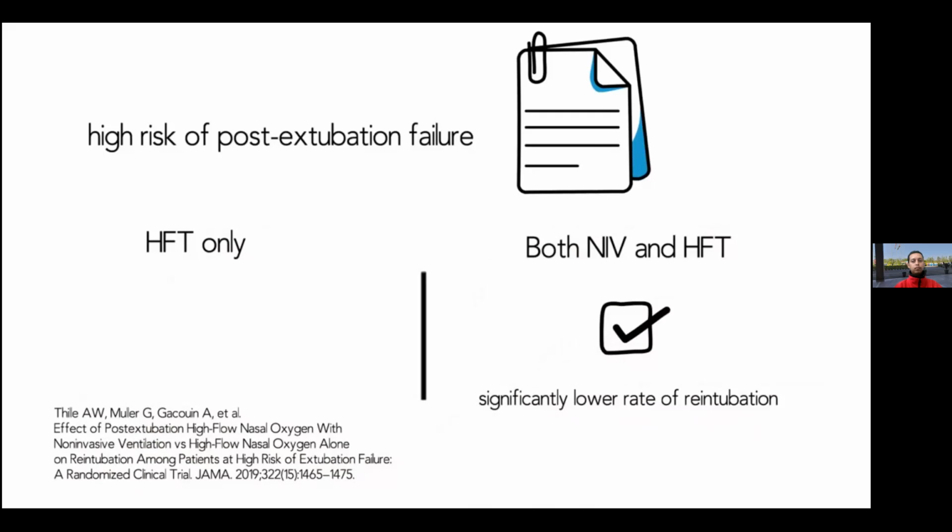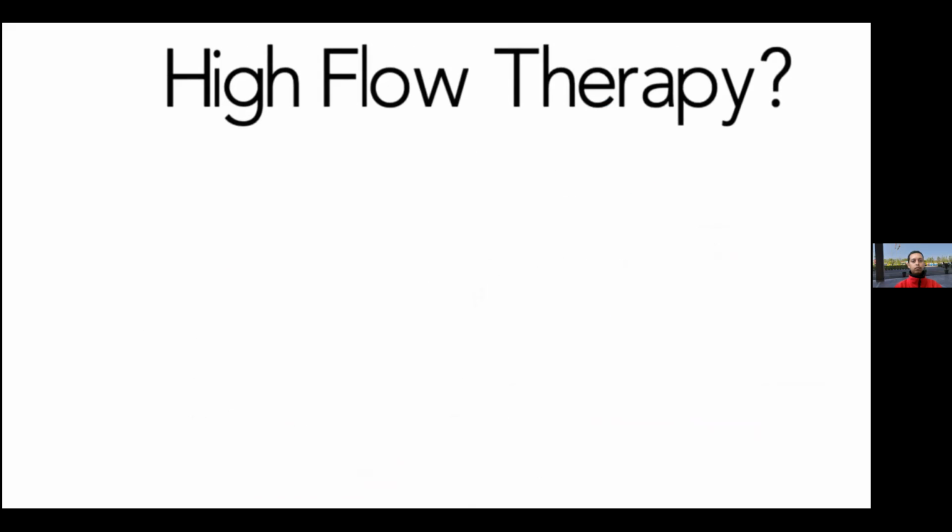So don't get confused. HFT is definitely not mask-free NIV. But it is a great tool to treat patients with oxygenation issues who are in respiratory distress. So, just a quick final summary on high flow therapy.